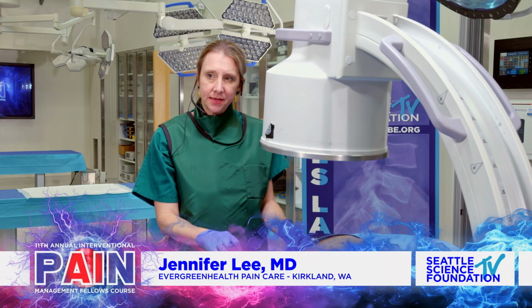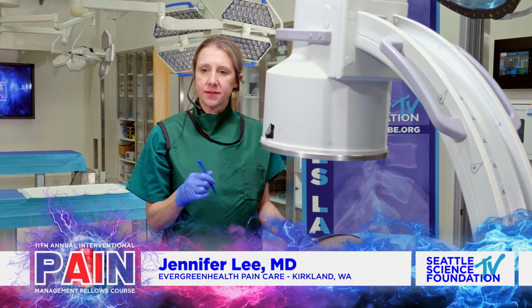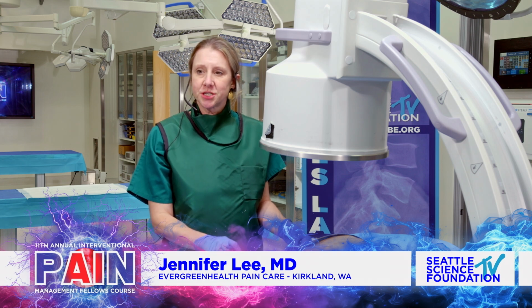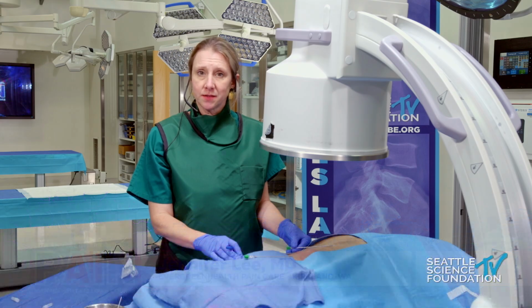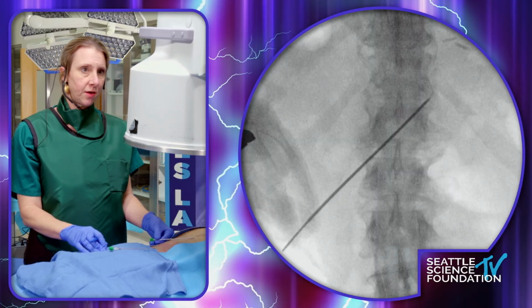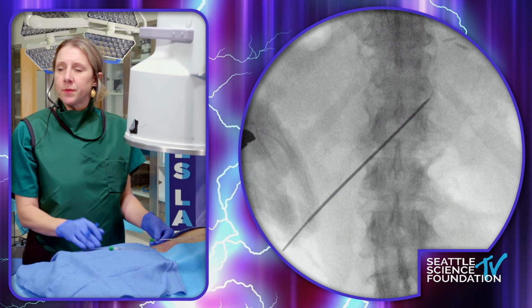Okay, so I'd like to have the picture centered on the specimen here. This is a demonstration of dorsal root ganglion stimulation. So if we could have the camera centered on the specimen. Okay, well, this will be fine.